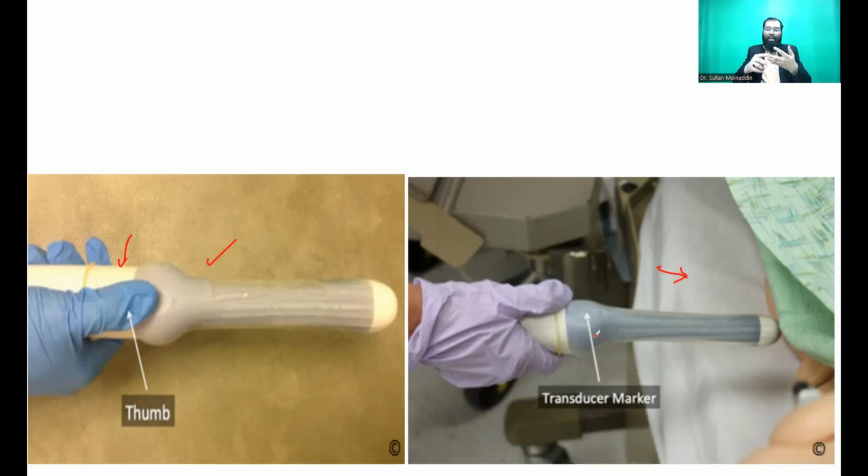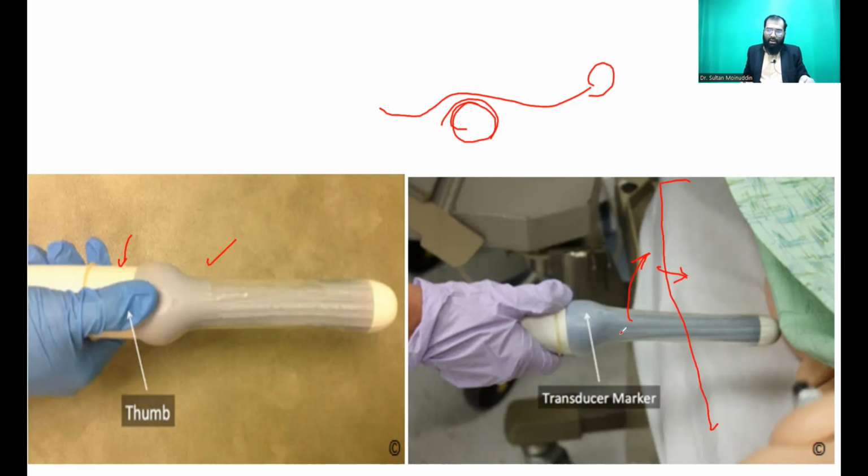A female attendant should be there. Next, you put a pillow under her waist. If this is the patient, and this is the cranial end, you put a pillow under her waist and take her in lithotomy position, just like we do in case of delivery. The table should be like this, the gynac table which we have, because only then is antero-posterior or supero-inferior manipulation of the probe possible, or else your probe won't go below this end and you won't be able to visualize nicely. So always have the end on the table.